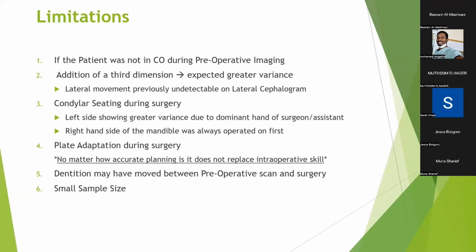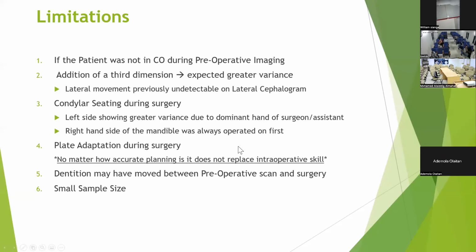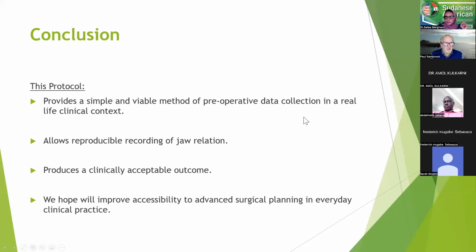You know, that if there was a long delay or there was active orthodontic treatment, then unfortunately your wafers were not going to be accurate. And we had a small sample size here, so we're not trying to make great definitive statements here, but really it was just an indication of the sort of things that may be an issue with the VSP.